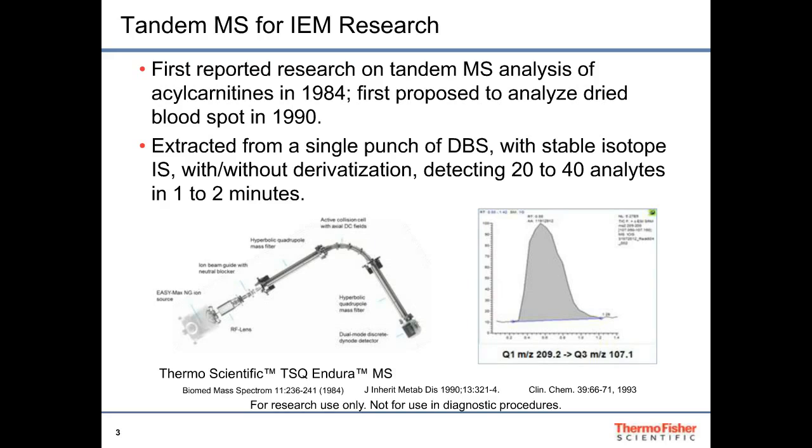Specific transitions from precursor to product ions are recorded and presented by the mass spec's software, enabling us to measure how much of each transition was formed from our sample. By mixing our sample with a set of stable isotopes of our analytes of interest, the system can measure the transitions of those as well as the sample analytes themselves. And that allows us to estimate the amounts of each analyte in our sample. This technique is known as isotope dilution.